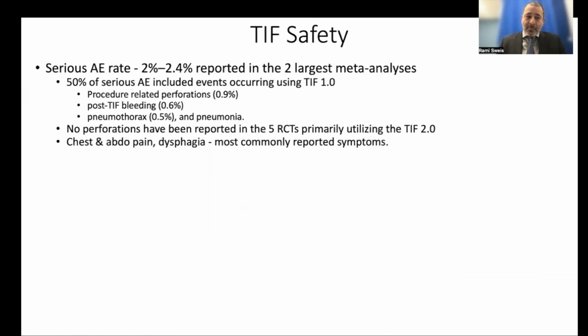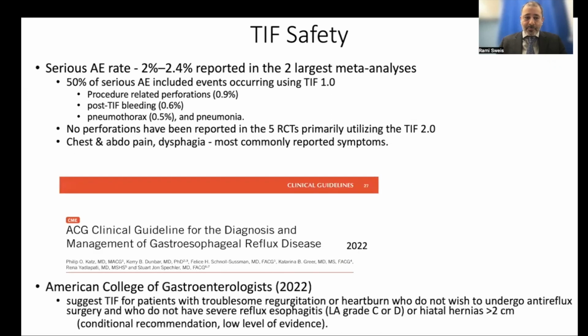TIF is safe. Only 2% of patients reported serious adverse events, and 50% of those serious adverse events were in the TIF1 group rather than the more advanced TIF2 group. No perforations were seen or reported in the 5 randomized controlled trials using TIF2.